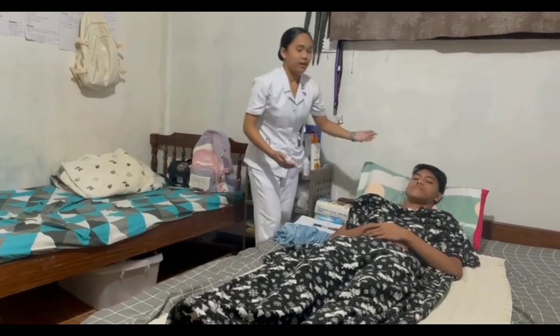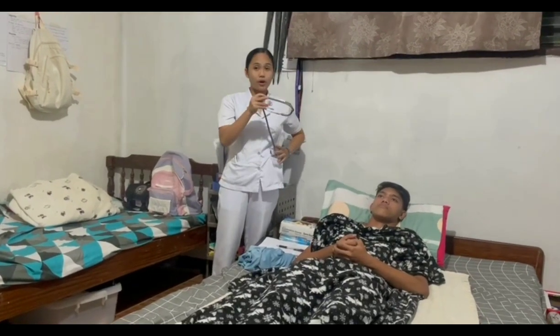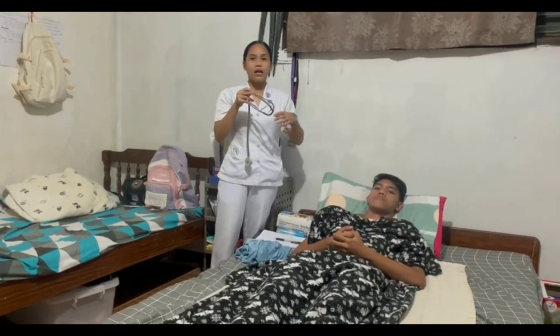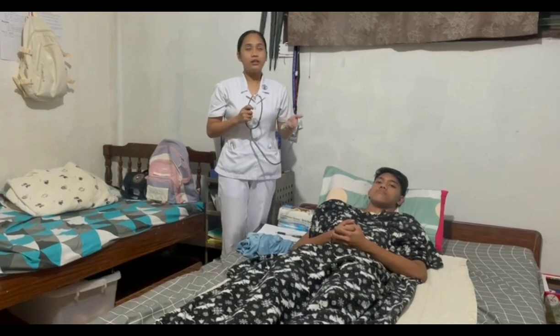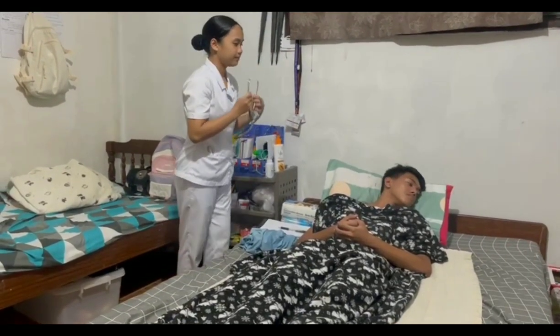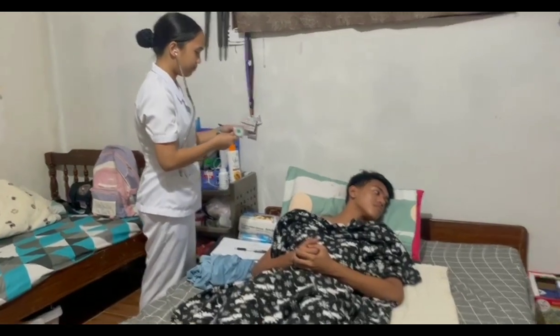Okay, thank you. Next, I'll be using my stethoscope and placing the bell over the carotid arteries and listening for a bruit, or a swishing sound that is caused by turbulent blood flow through a narrow vessel, and also repeat on the other side.